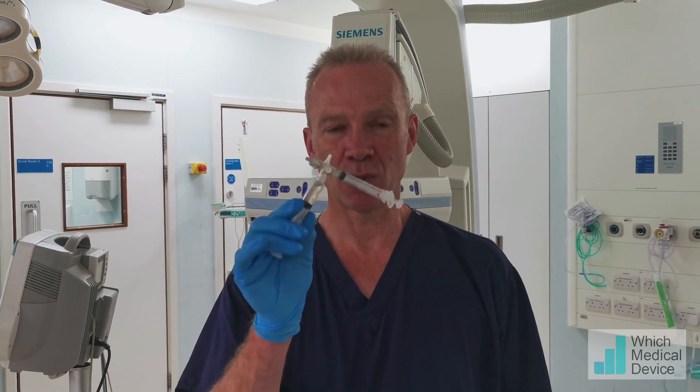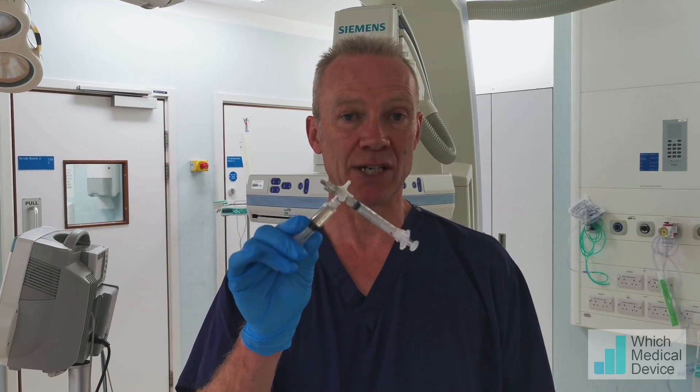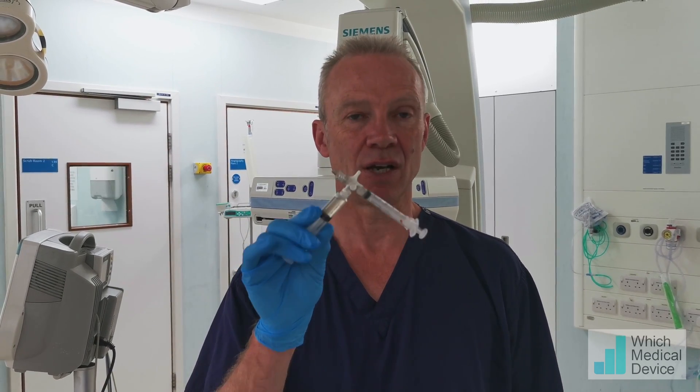We've just been doing a prostate artery embolisation and it was a really straightforward procedure. It took us about an hour and a half to do both sides. This is what I normally use, which is a mixture of glubran to lipiodol in a ratio of 1 to 8. And it works really well.